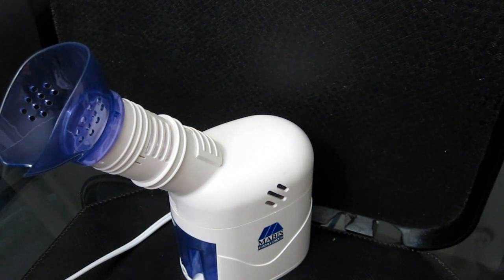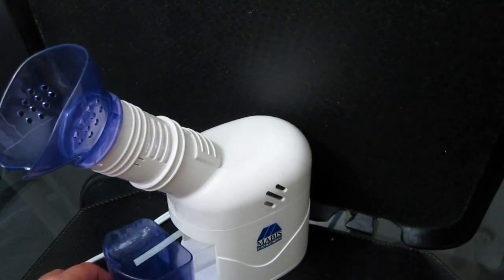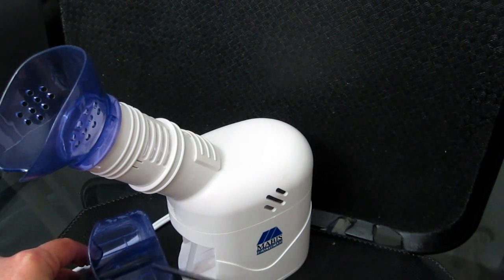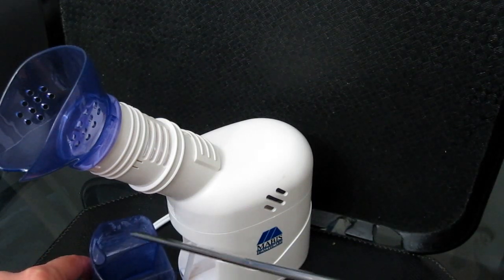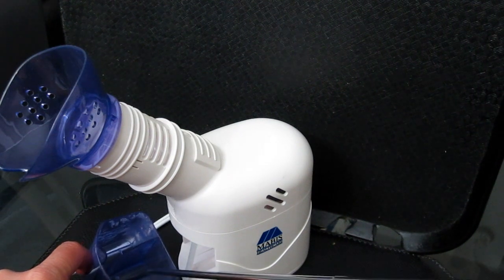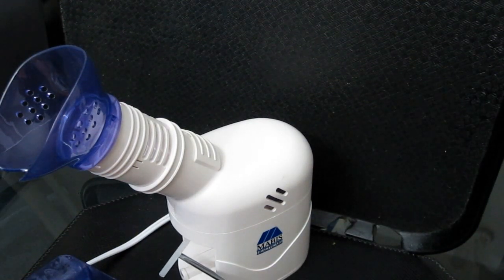I also wanted to run through some of the parts real quick. There's actually a diagram that comes with the instructions that's mislabeled. This is one of the water tanks. There's two sides to it, a smaller side and a larger side. The smaller side is actually for extra steam, or actually water condensation buildup, and it's basically not a reserve tank but an outflow tank. This side is used to add your essential oil and water together, and that water is drawn up through this. I can't really see it here, but there's a little hose here.